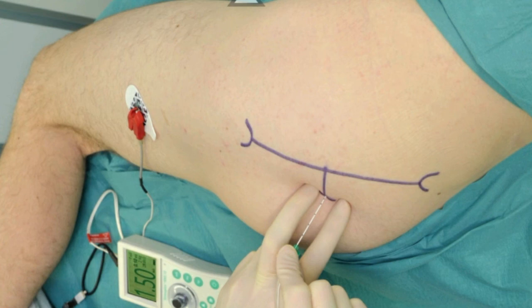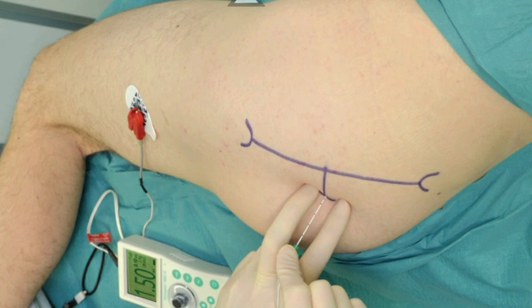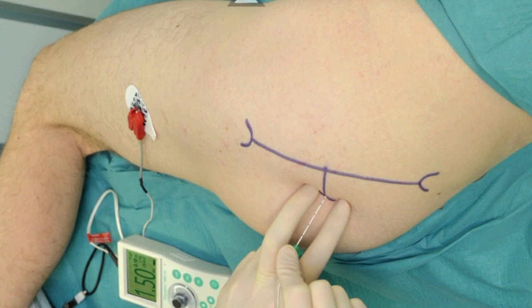Twitches of the hamstrings are equally acceptable because this approach blocks the nerve proximal to the separation of the neuronal branches to the hamstrings muscle. Once the gluteal twitches disappear, a brisk response of the sciatic nerve to stimulation is observed — either hamstrings, calf, foot, or toe twitches.